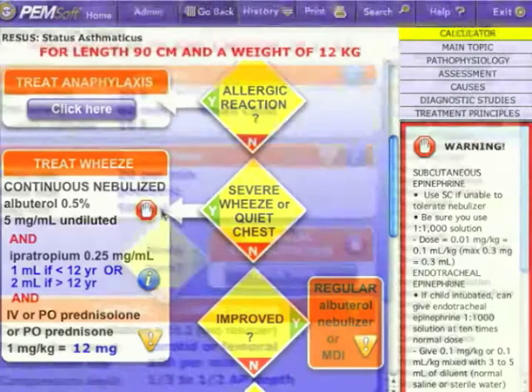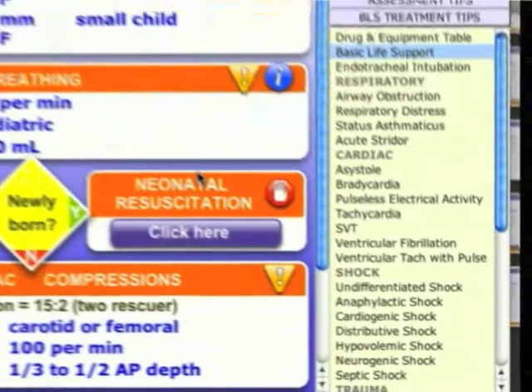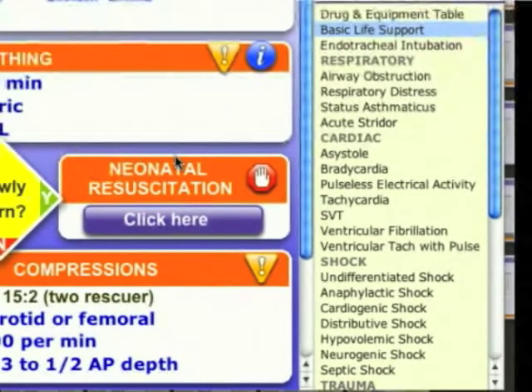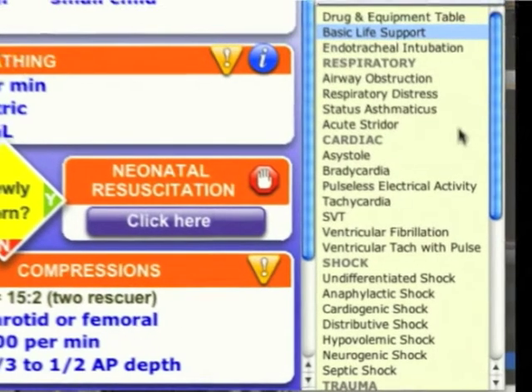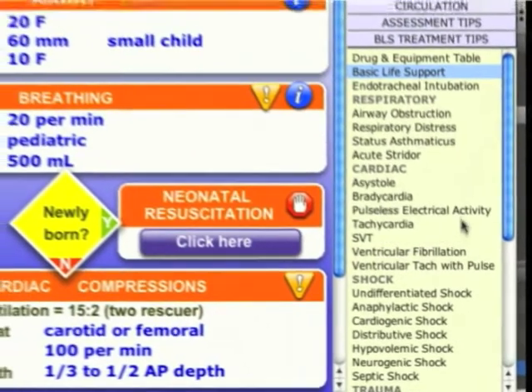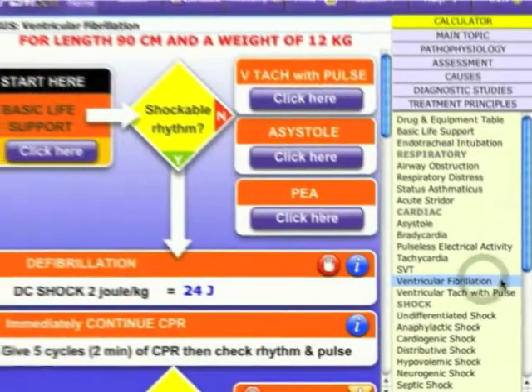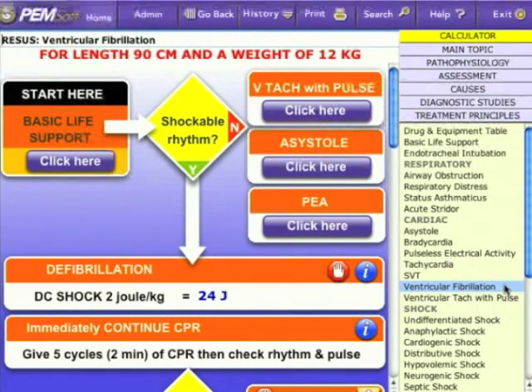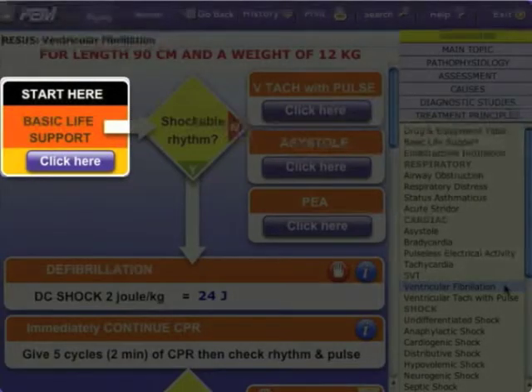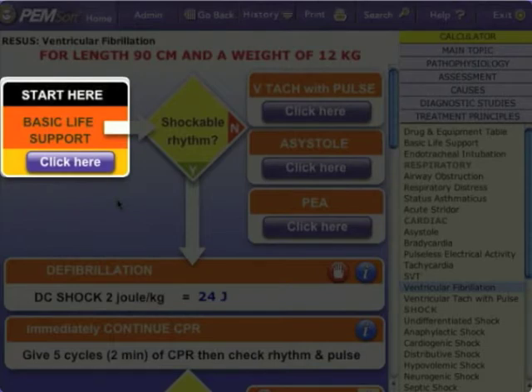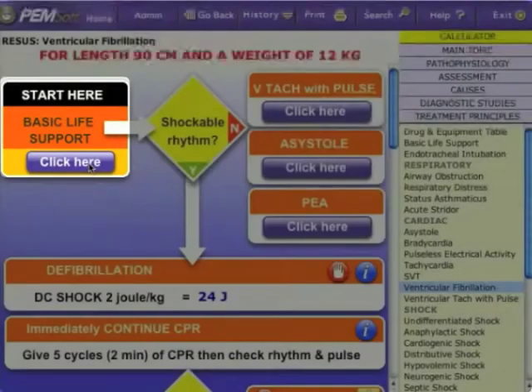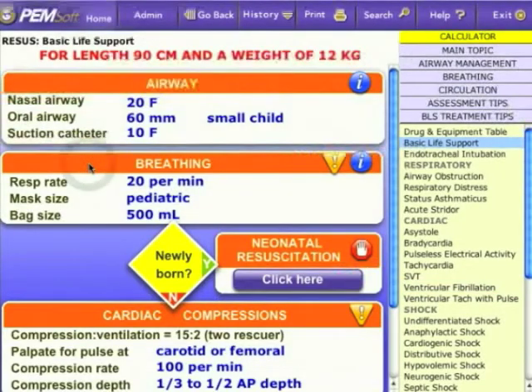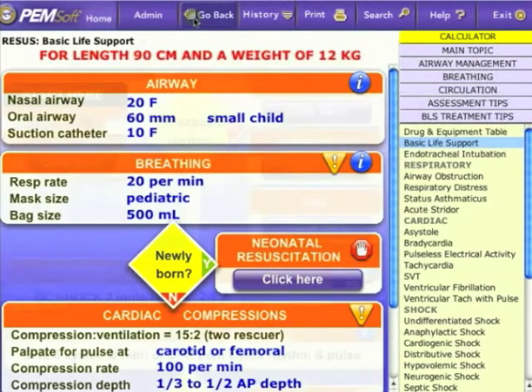Because patients may actually progress from one critical condition to another, you can similarly move easily within the list of resuscitation protocols by clicking on a different topic in the bottom right column. In this case, let's say the child went into ventricular fibrillation. Select this topic. This new algorithm starts at basic life support. The purple Click Here button allows you to review the basic airway, breathing, and circulation maneuvers and equipment indicated.